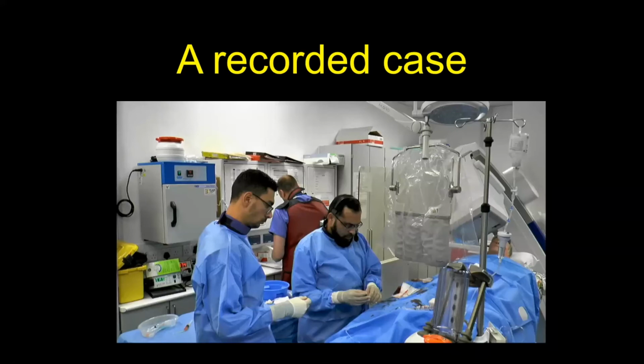Farhan, can you? Farhan is saying, I would stent an occluded vessel without hesitation. This is what happens in STEMI often. Yeah, that's what I would do. I think what Iqbal is saying is right. Obviously, it's case-based, but in common practice, say there's a 75-year-old, everything fits with the STEMI, I'd probably be a lot more comfortable in that scenario. Yeah, when common things are common.